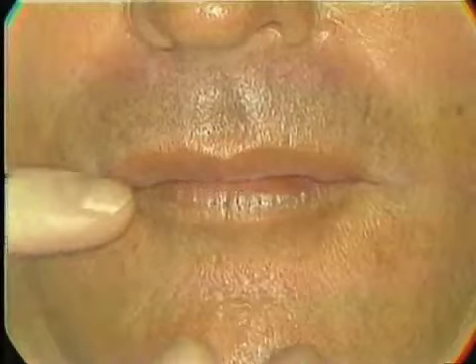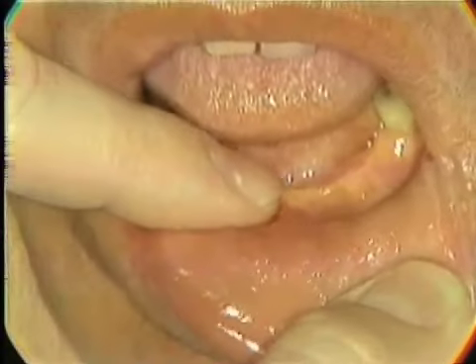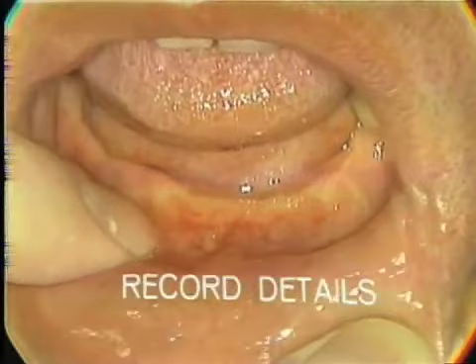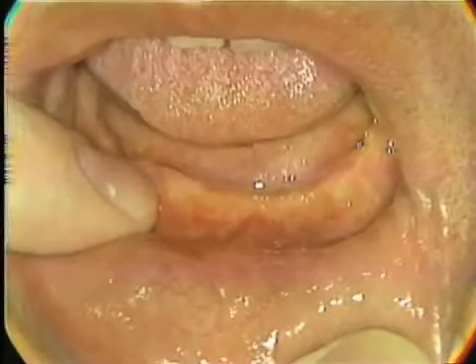The tissues of the mouth and the ridge area are not smooth. There's lots of little wrinkles and irregularities in the tissues. The object of this impression procedure is to pick up all these little minute details in the impression material with a free-flowing impression material. And we would have these recorded in our impression.